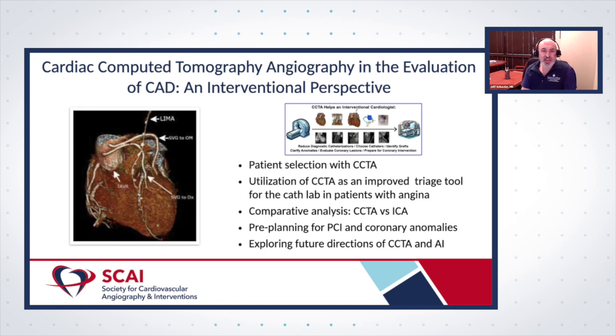But when I think of cardiac CT, at least for chest pain, there's usually two questions that we're asking. Does a patient need to go to the cath lab, and does a patient need statins? Those are fundamental to when we're looking at coronary disease for chest pain. And the interventionalists gain a lot of information as far as who needs to be taken care of with more invasive procedures. But there's even some nuances that I think the current reading specialists should probably be focused on, and things that affect us in the lab.